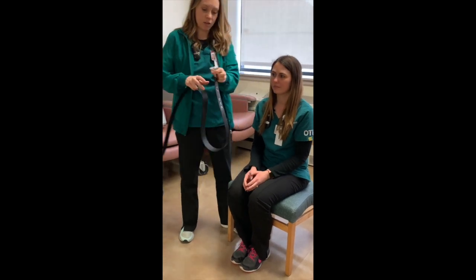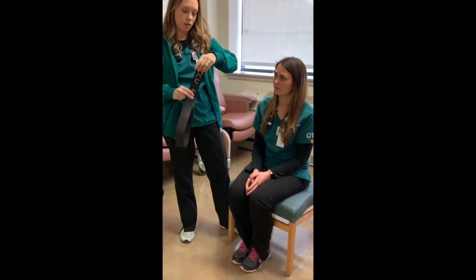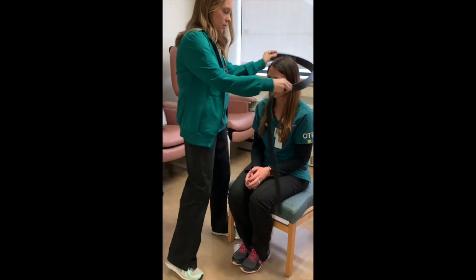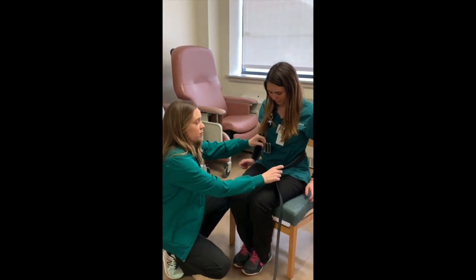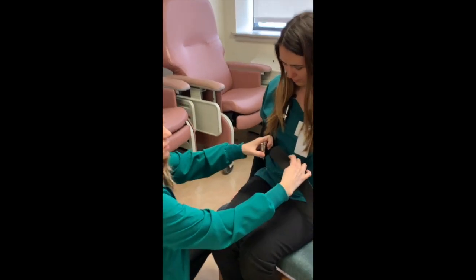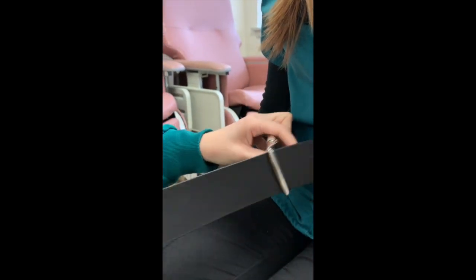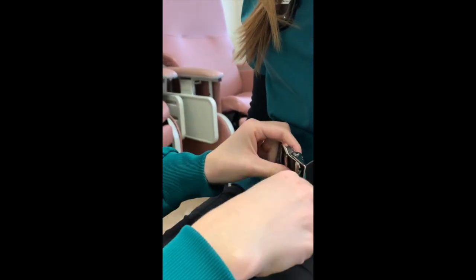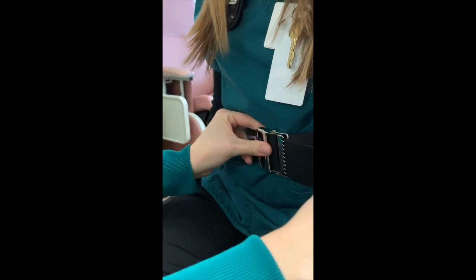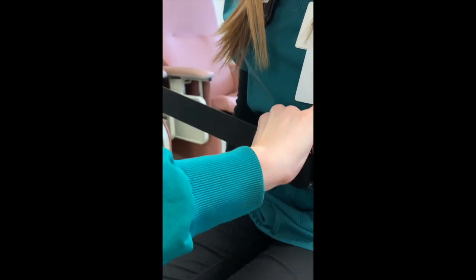So first of all, on the gait belt you have a teeth side and then a smooth side. You're gonna bring the gait belt around with the teeth side closest to the patient, and then you're gonna bring the other end through the strap on the teeth side. Bring it around, typically at mid-waist or the true waistline. Cinch it up and then bring it around through the other end.